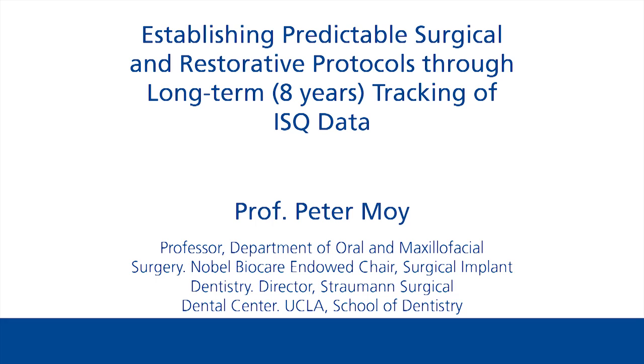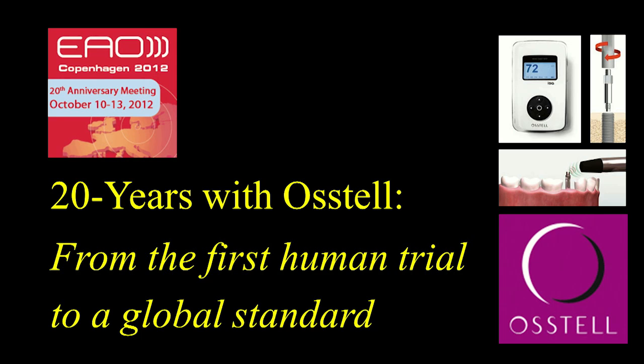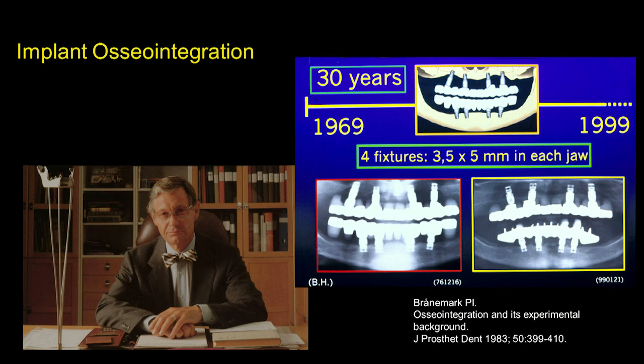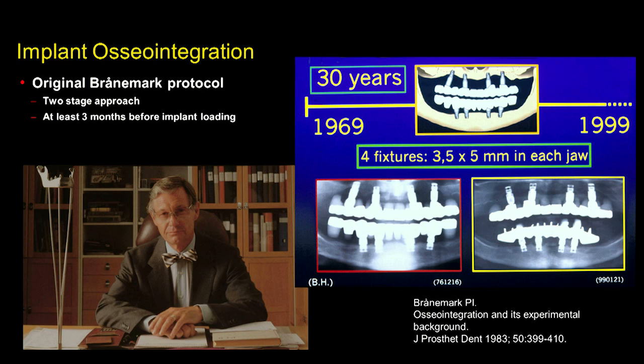So, please. Good morning. It's a pleasure for me to present to you this morning on 20 years with Osstell, from the first human trial to a global standard. I was asked to present this topic on establishing predictable surgical and restorative protocols through long-term tracking of ISQ data. As has been very well covered, the initial protocol for osseointegration was a two-staged approach, whereby the implant that was placed is permitted to heal. And this healing period took a specific period of time, typically not less than 3 months.